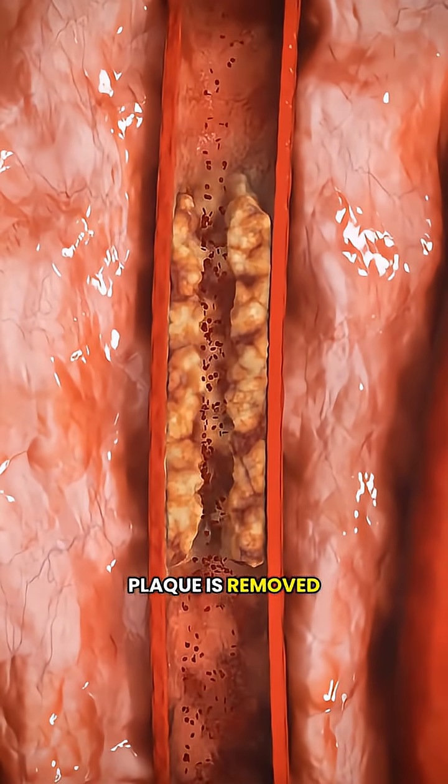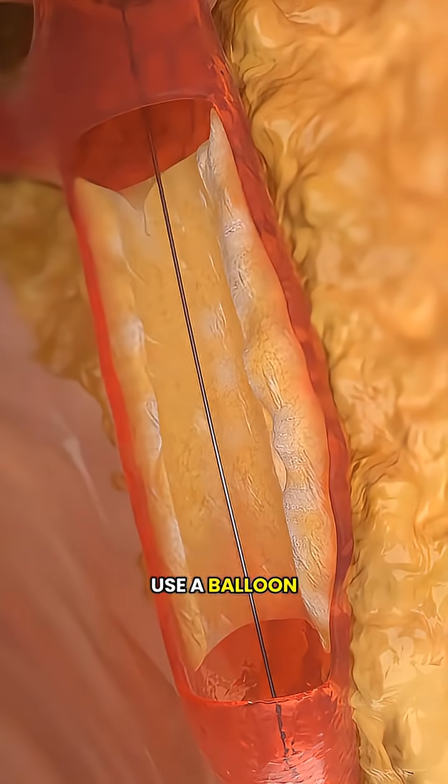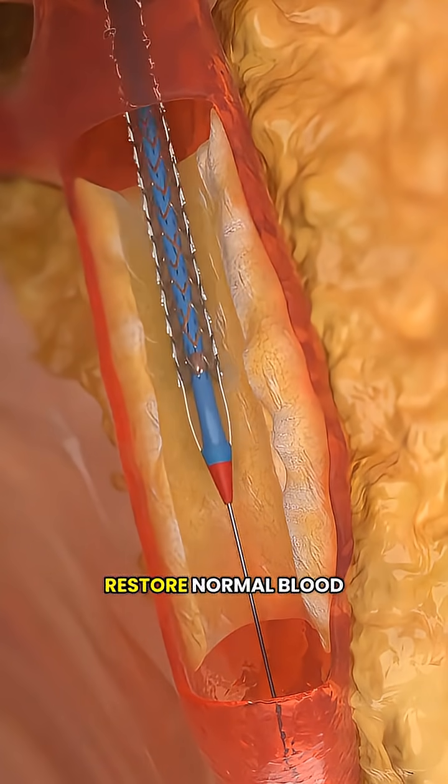Once the rigid plaque is removed, the artery becomes softer and easier to open. At this point, the doctor can use a balloon or place a stent to fully restore normal blood flow.